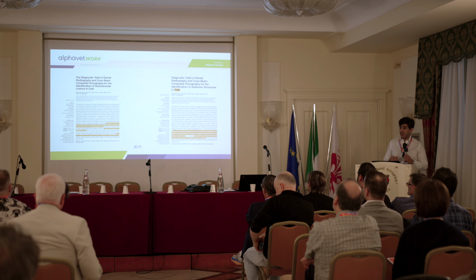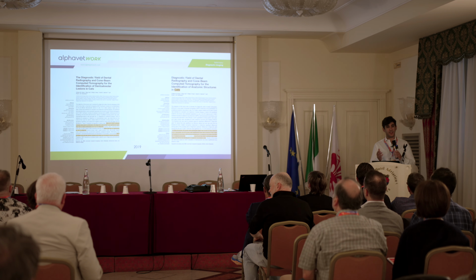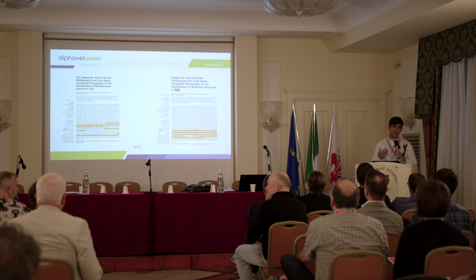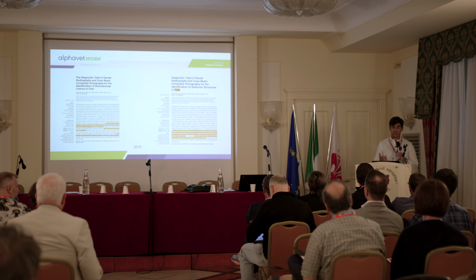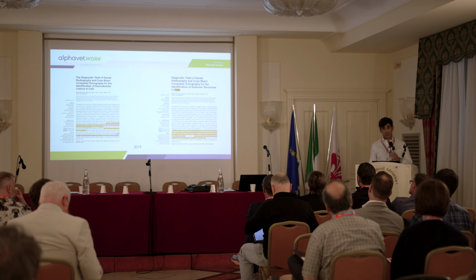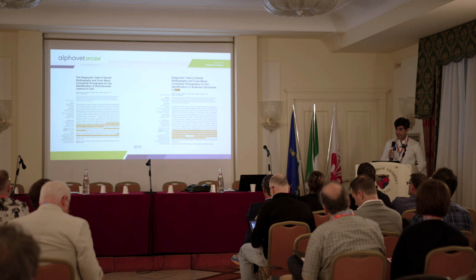In 2019, we're still going for the cats. Why is that? Who has a CT? I have a CT. You know, for the cats, you have to stress your machine a lot, and sometimes you're missing some dental issues. While with the CBCT, it's demonstrated that we have a good presentation of all the dental alveolar lesions in cats, and you can see the anatomical structures.